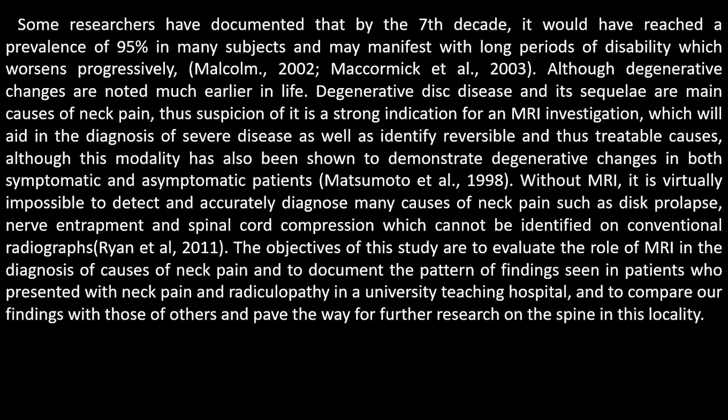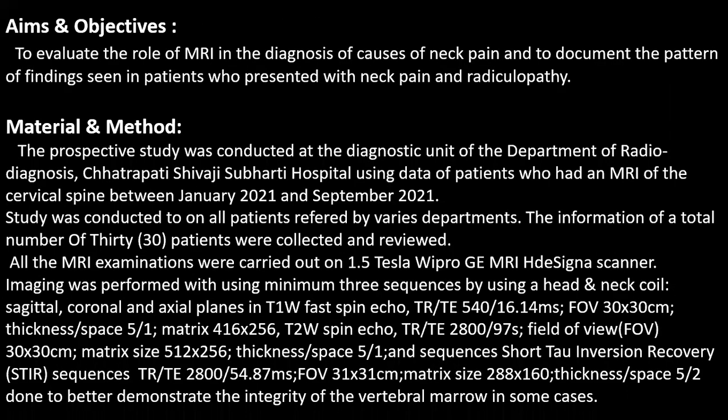The objective of this study is to evaluate the role of MRI in diagnosis of the cause of neck pain. Aims and objective: to evaluate the role of MRI in diagnosing the cause of neck pain and to document the pattern of the findings seen in the patients who presented with neck pain and radiculopathy.